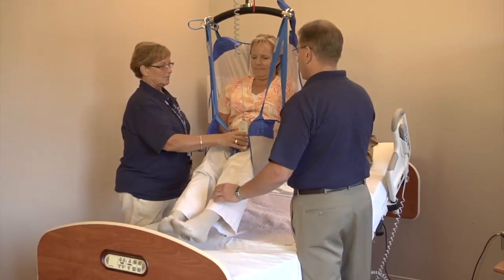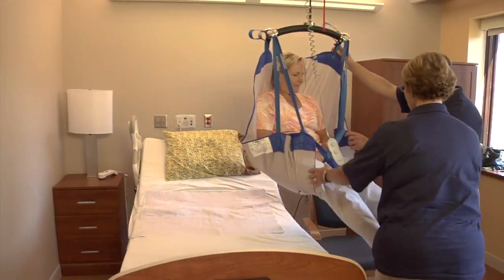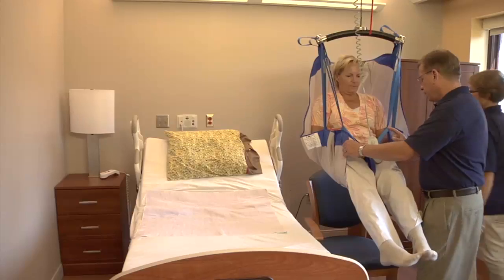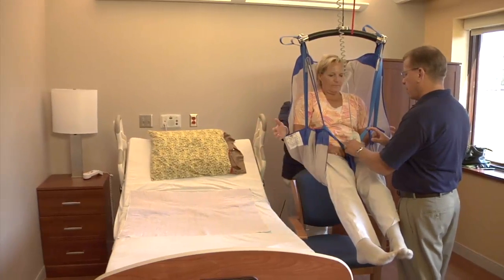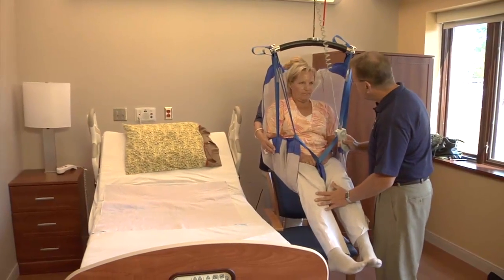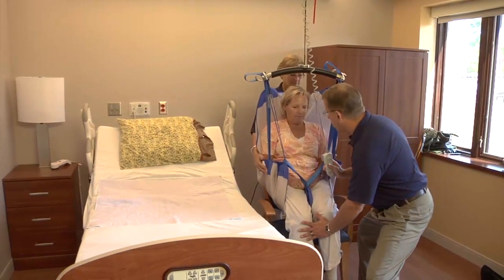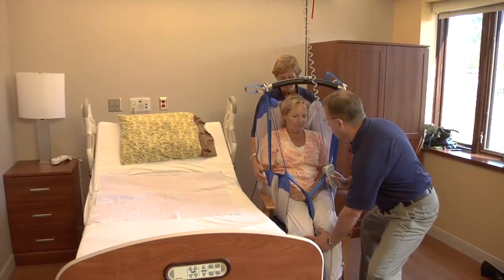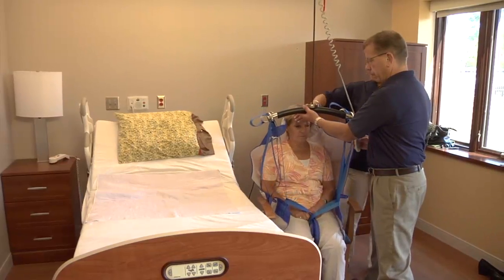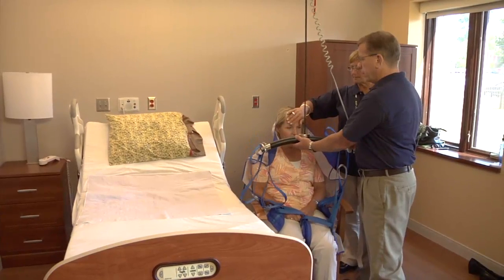Same thing if the patient was in a chair. They'd be lifted over their chair and not moved until we were sure they were attached correctly. Never move a patient without 2 assists. You're guaranteeing that you're monitoring the patient's position and comfort and safety while somebody is controlling the machine. A gentle push at the knees guides the patient's hips back into the chair. There is no reason to hang on to the handles of the back of a sling and pull a patient into position.